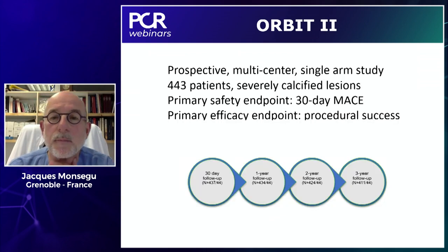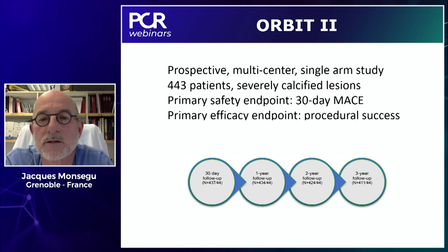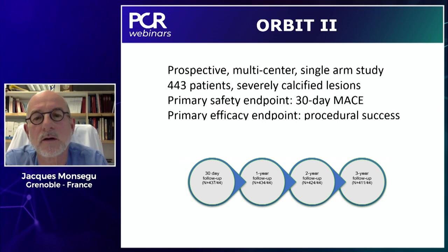TLR. More interesting is Orbit 2 study, the prospective multicenter single arm study, more than 400 patients and two primary endpoints. The first, safety with the 1 month MACE, and the second endpoint is efficacy endpoint with a procedural success.